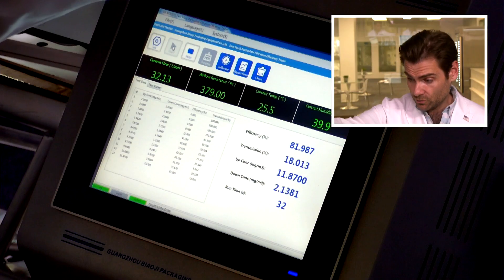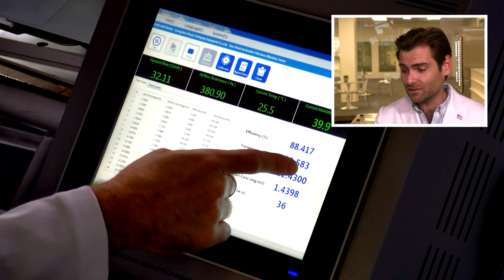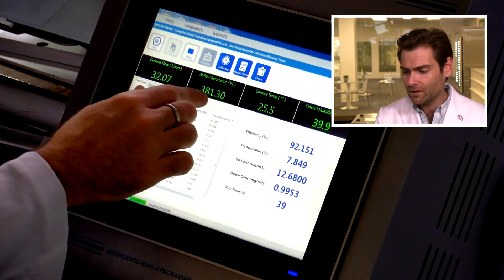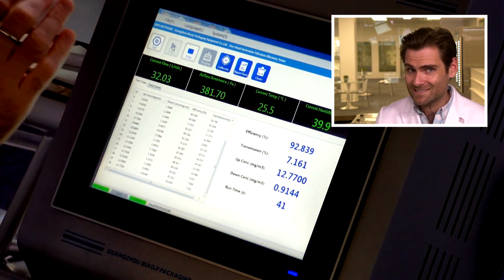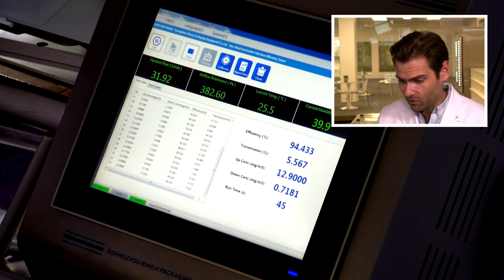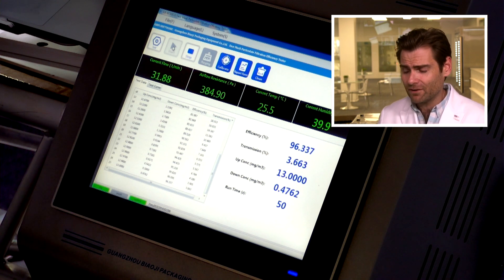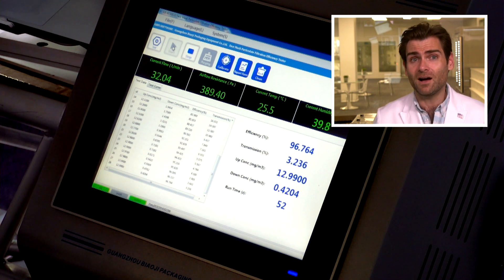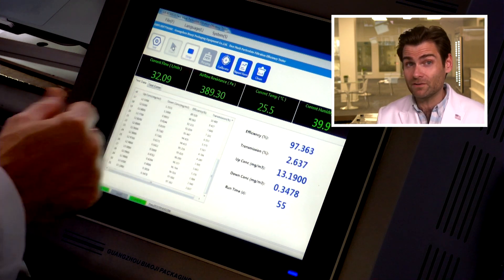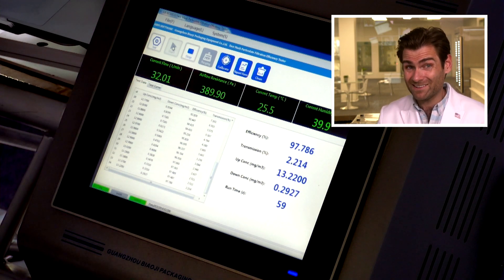Something I'm noticing right away on this mask — the filtration efficiency has probably climbed a little bit but it started kind of low, and the airflow resistance is insane. It's really really hard to breathe through. The N95 standard needs to be under 250 pascals, but really you want to see under 150 pascals, and this is more than double that. I'm going to try on the mask and see how it actually feels on the face.